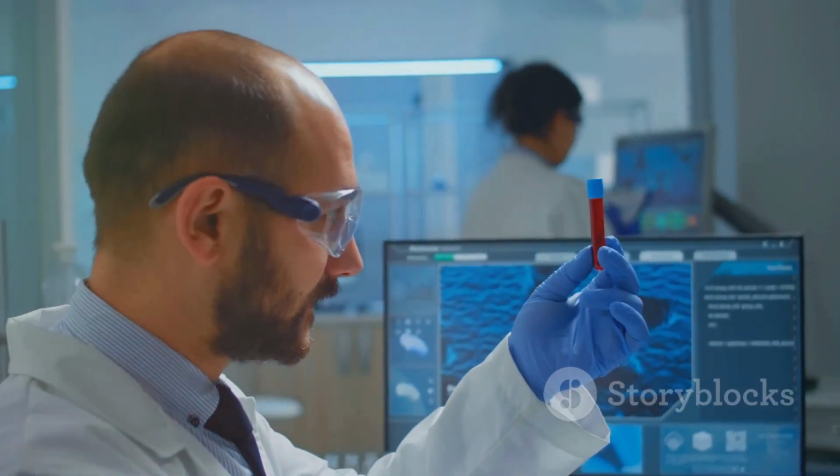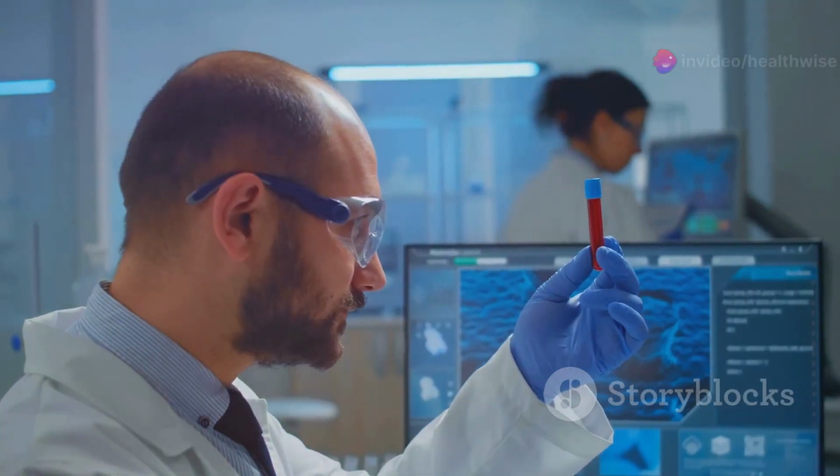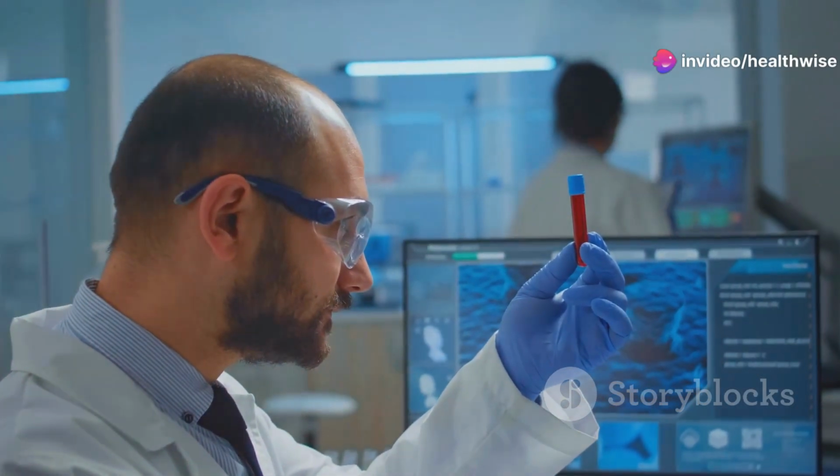And here's a tip: finding more than 1 WBC per 1,000 RBCs usually suggests the presence of meningitis.